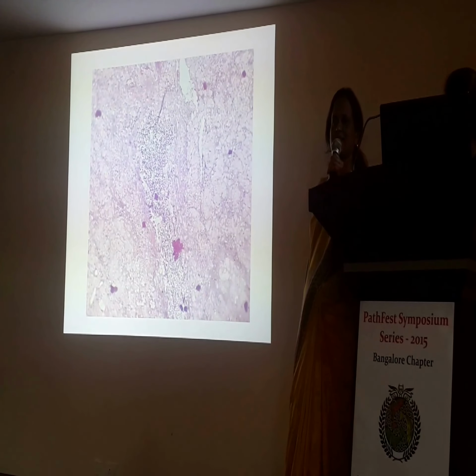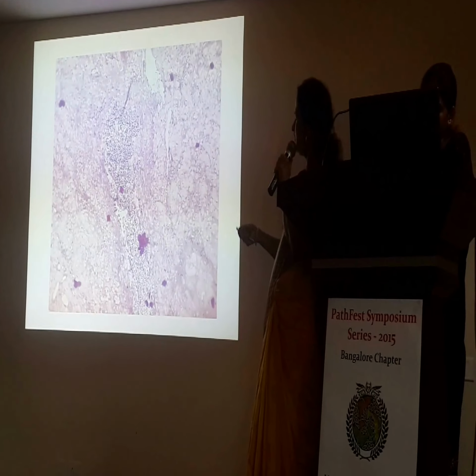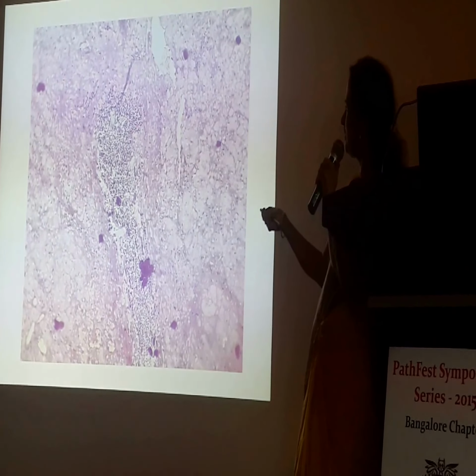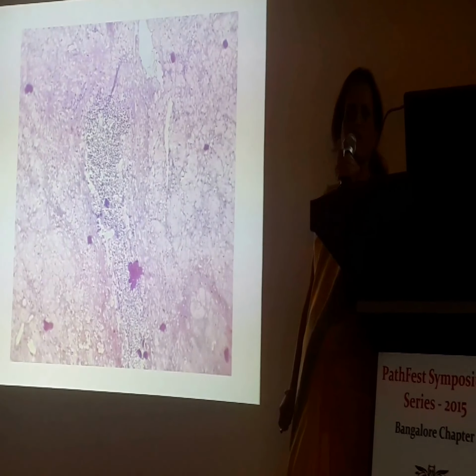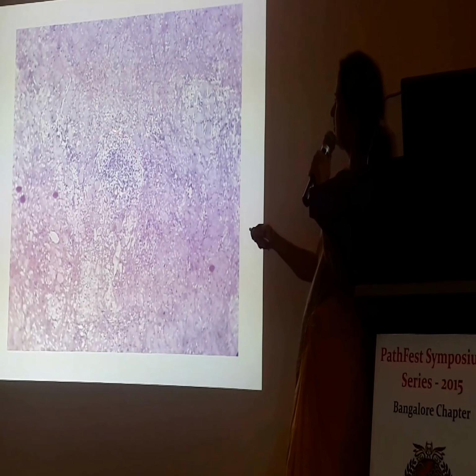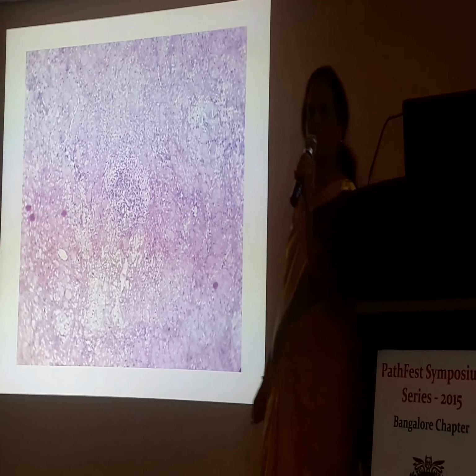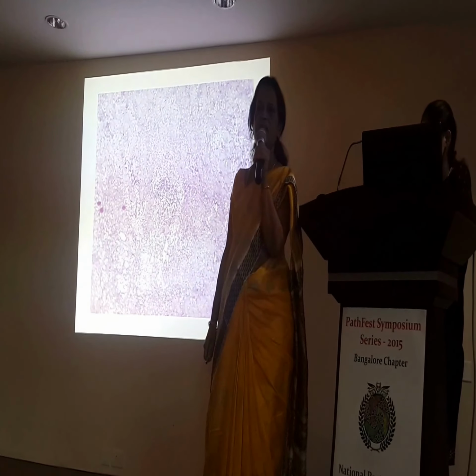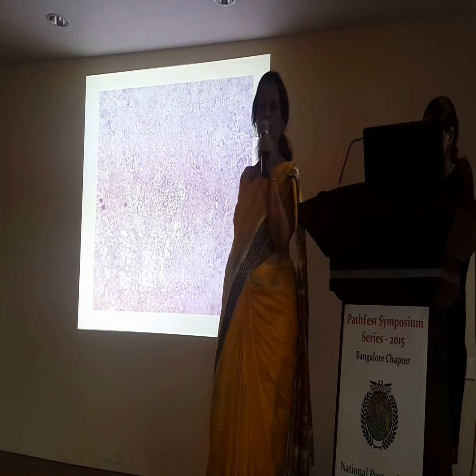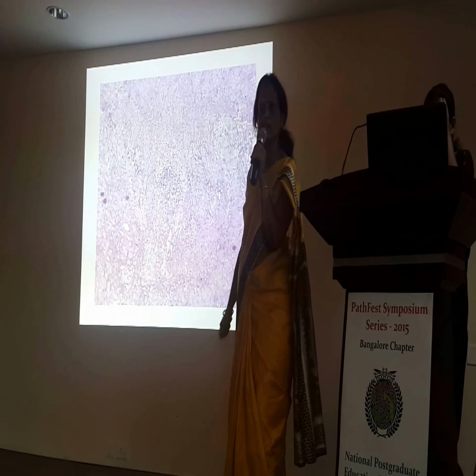What is this? The only thing that is visible is the lymphoid tissue, right? Next. All these, they don't have their morphology. Only outlines are there, no morphological details. So you can make out, this is an aggregate of lymphocytes. Anything that you want to see there? Next.